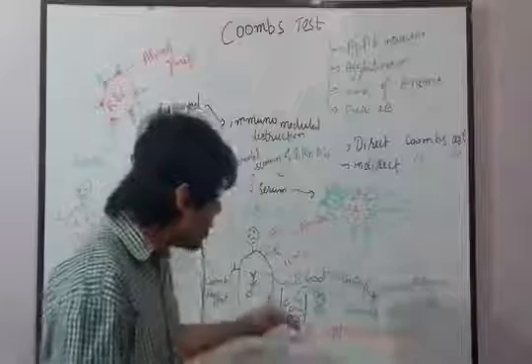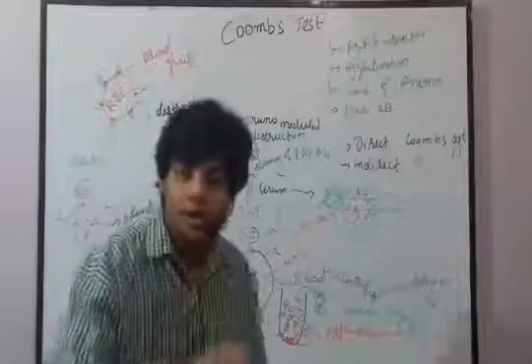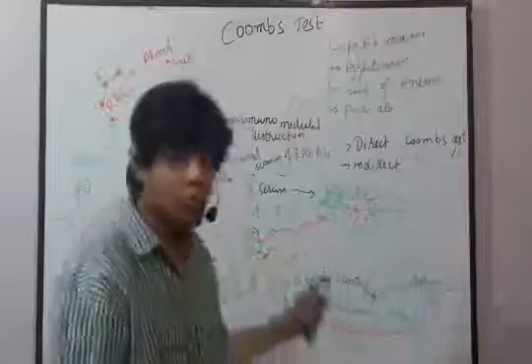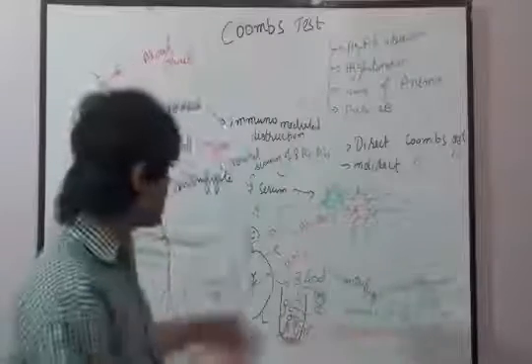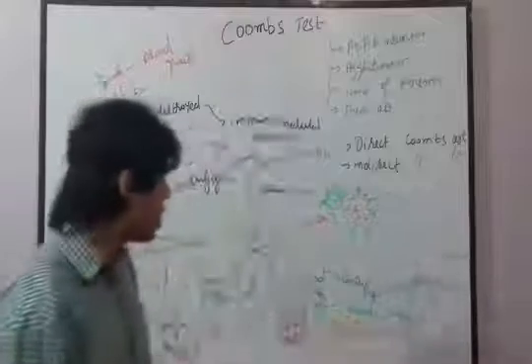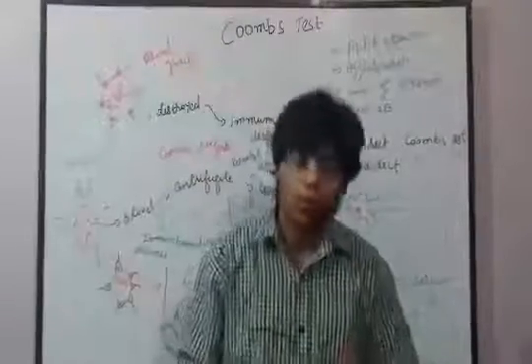Fine. When agglutination does not occur, it means that the antibody is not present in this case, and we don't give any kind of medicine to this pregnant woman. This is about the indirect Coombs test. Fine. I hope you understand, and that's all about the Coombs test.